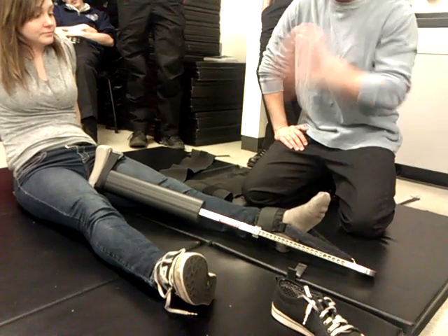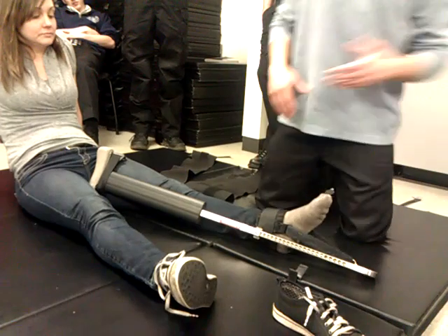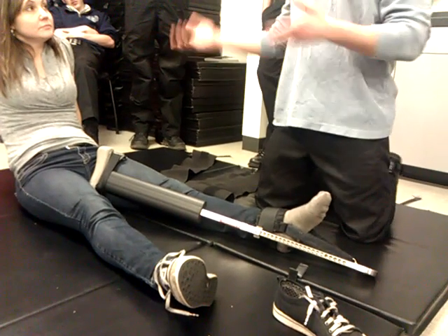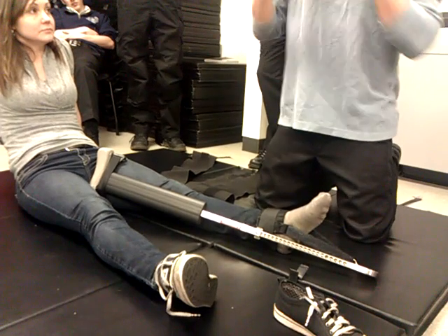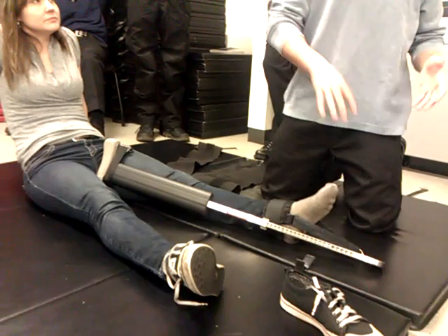So from there, this is the point where you're going to go ahead and apply traction. You're going to let your patient know that you're going to have to know their weight with the intention of being able to pull the right amount of traction. You don't want to embarrass them because some women, or most women, are programmed to not tell the truth about their weight. So when you do ask about their weight, you want to note that it's pertinent to applying the appropriate amount of traction.